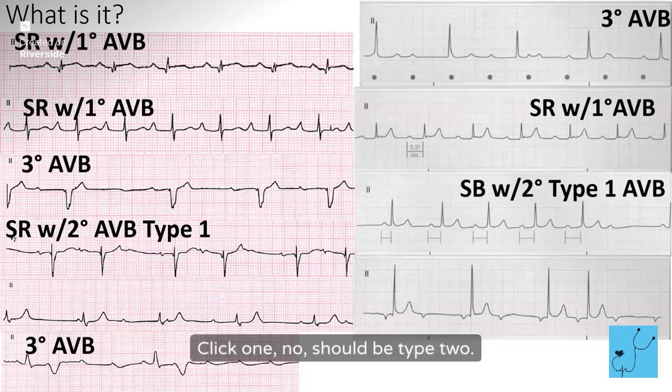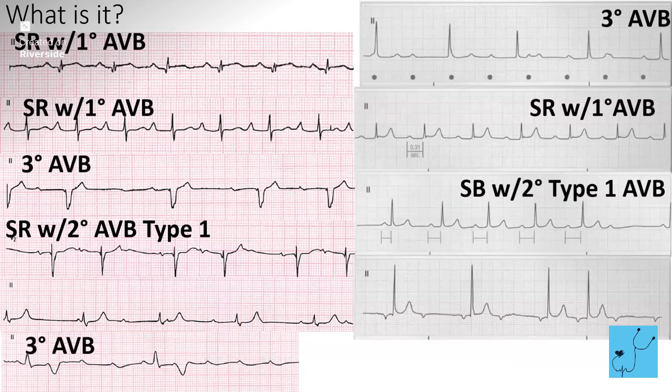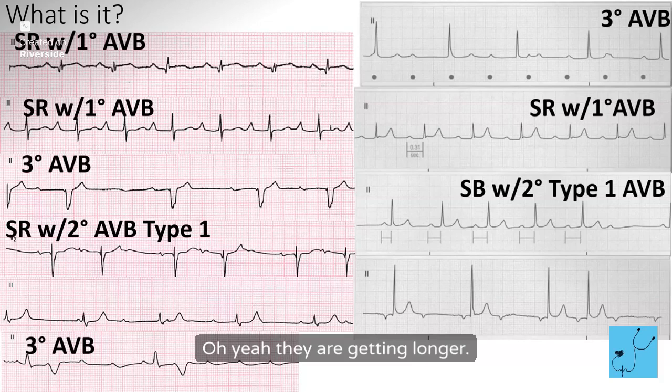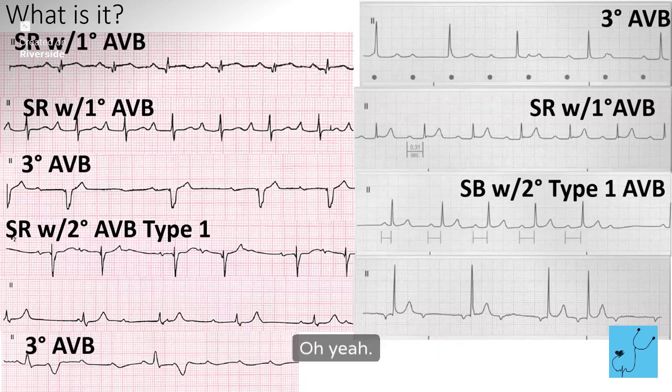Type 1, no, it should be type 2. These are all, oh no, they are getting longer. Look how short that one is. Oh yeah, they are getting longer. I went based off the book. Yeah, I couldn't see from this angle, they all look the same. Yeah, so it is a Wenckebach.